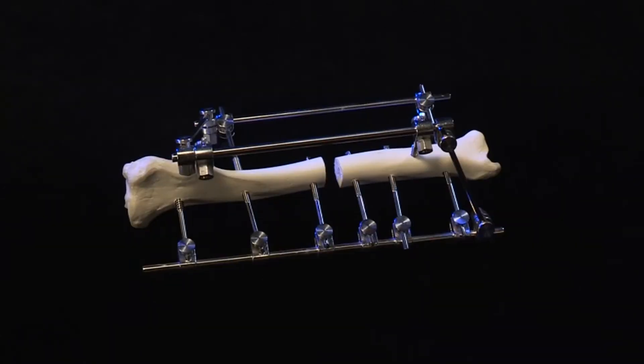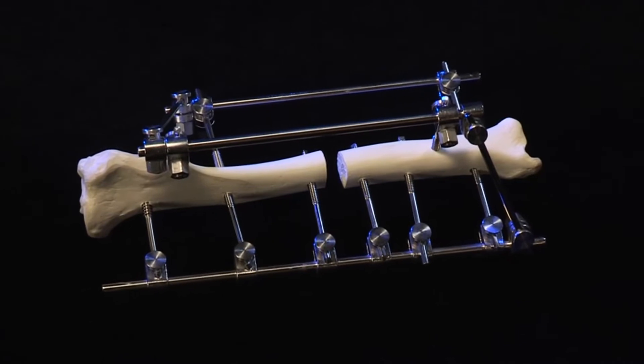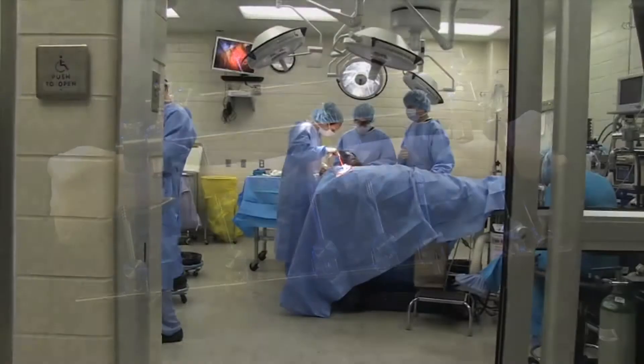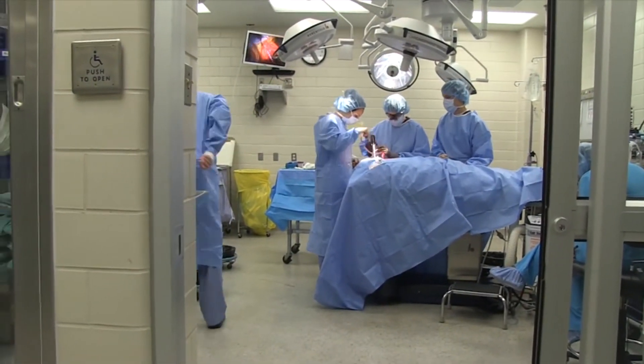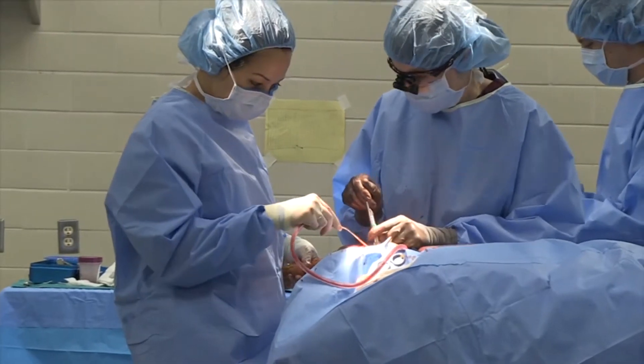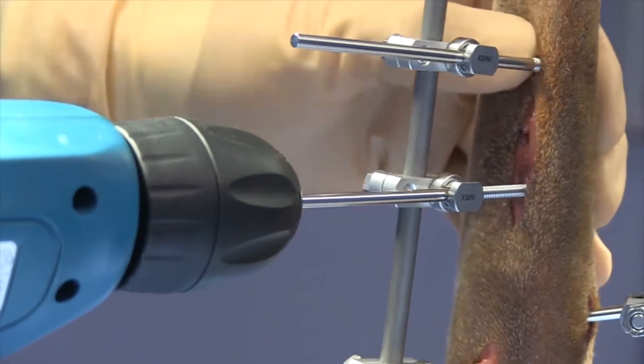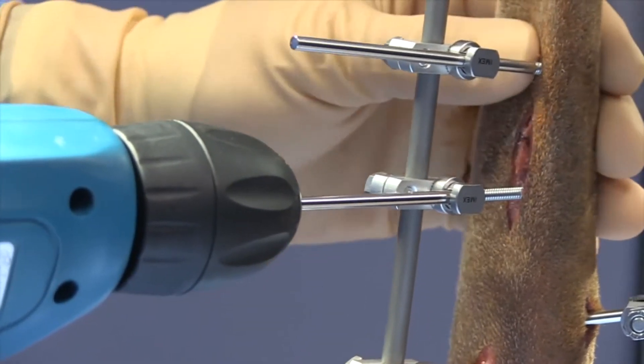The Kirchner Emmer or KE device was the primary external skeletal fixator in North America for many years. As veterinary surgeons began to understand external fixation with the KE device, they found it necessary to construct complex frames using modern ESF pins in order to limit patient morbidity and premature pin loosening.